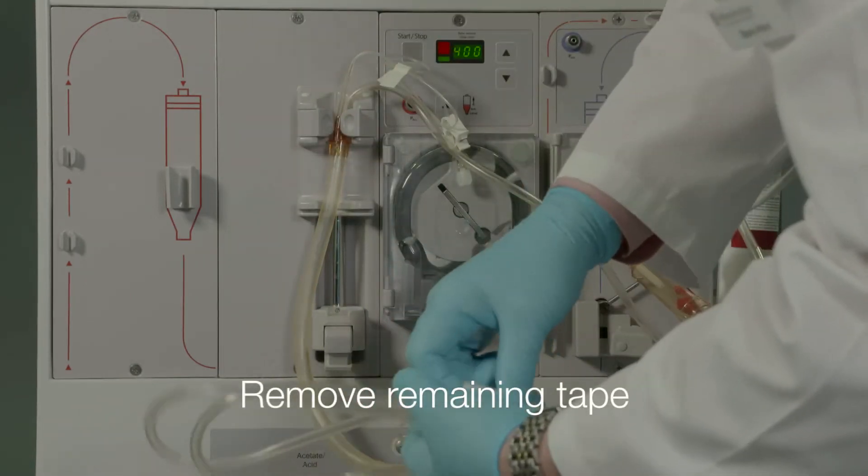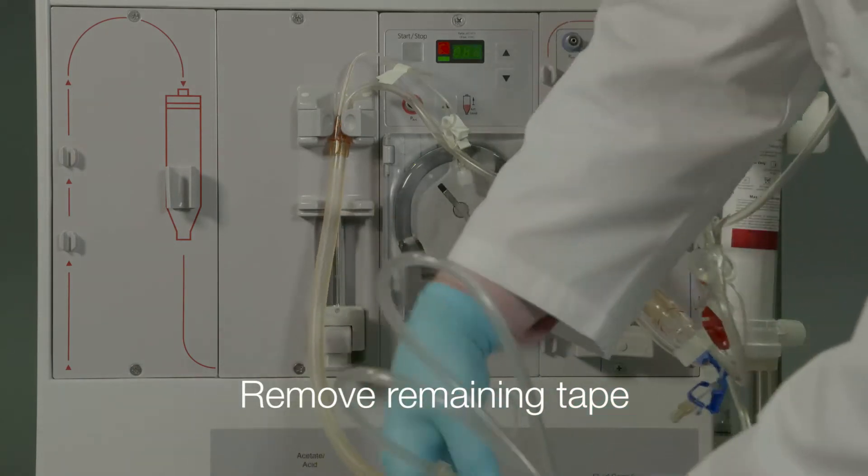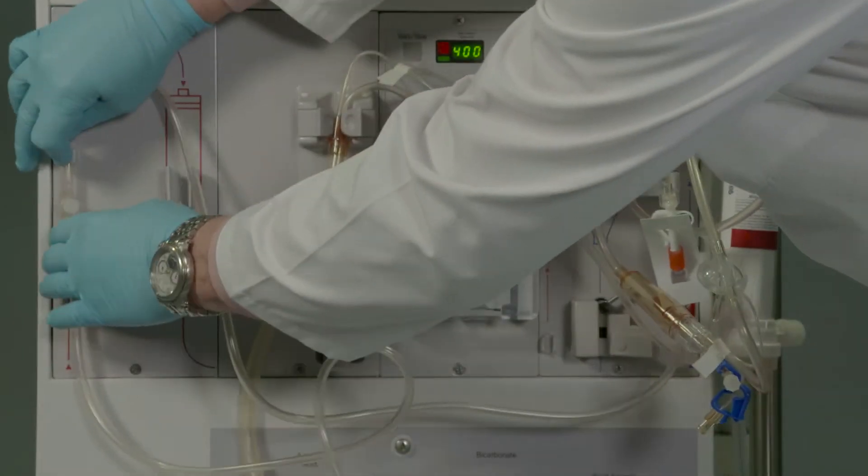Remove the remaining white tape from the arterial portion of the set and place on the machine for gravity priming of the pump segment, using tubing clips to prevent the tubing from touching the floor.